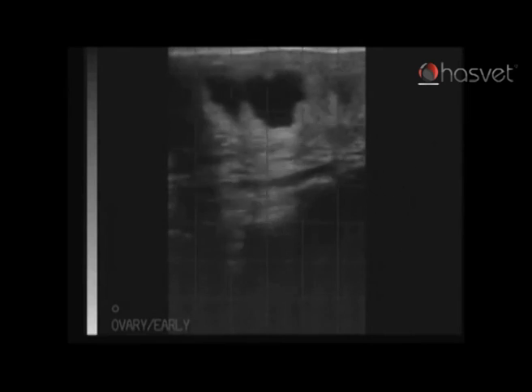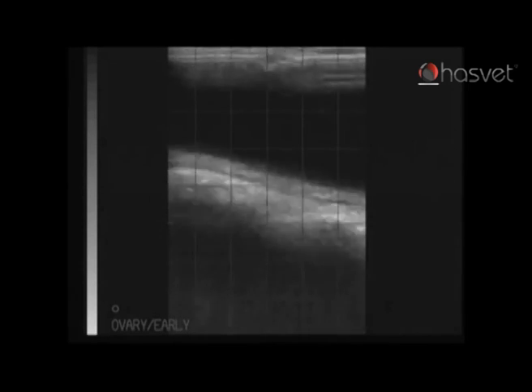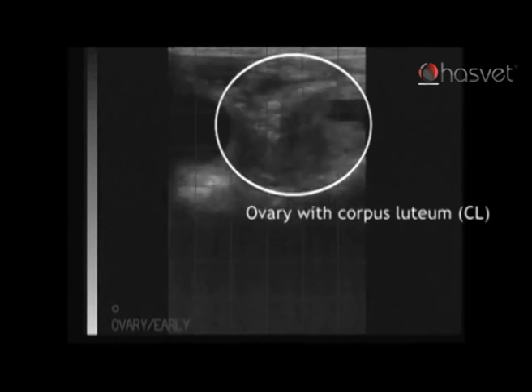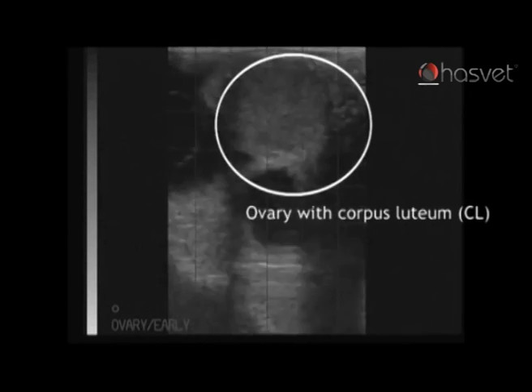We will then continue back down the horn and up the other uterine horn. At this stage the other ovary comes into view, with the presence of a corpus luteum — a gray, homogenous, smooth-appearing structure on the screen just now.